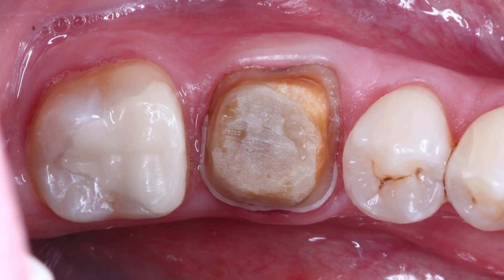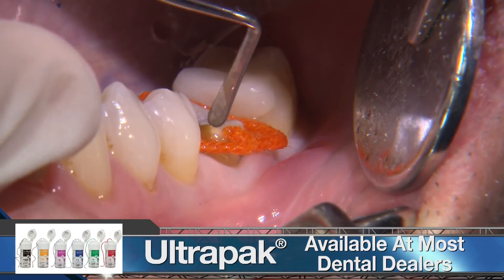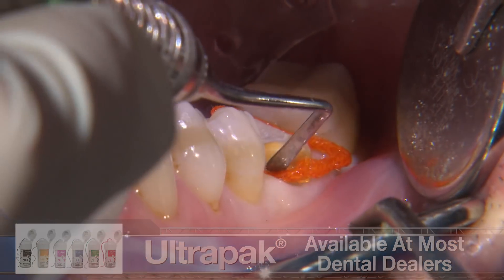To complete the prep, I ensure the axial walls have adequate taper and the internal angles are rounded. Next, I place a size 2 cord and let that sit for a few minutes while I prep the upper molar.